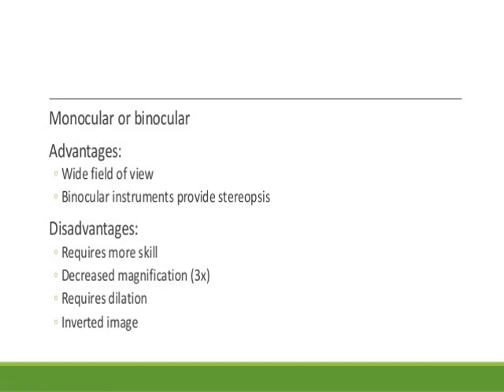Advantages: wide field of view, binocular instruments provide stereopsis. Disadvantages: it requires more skill and magnification is decreased. It requires compulsory dilatation of the pupil, and this is an inverted image.